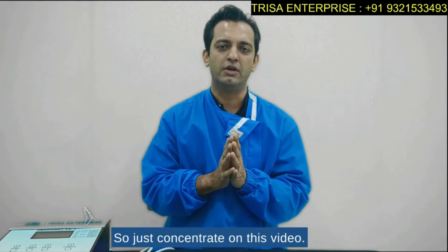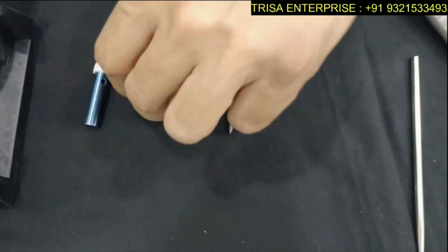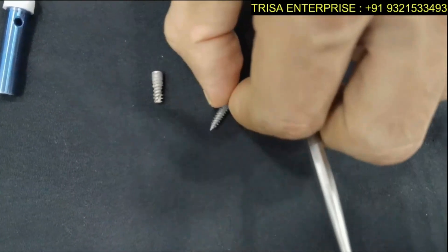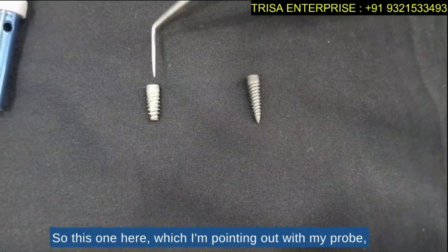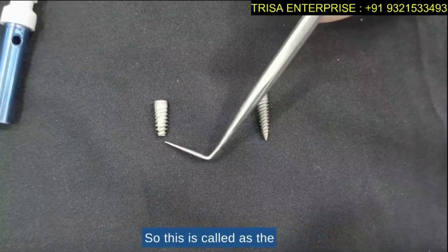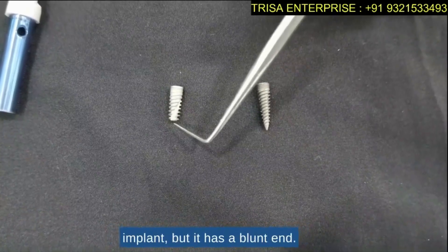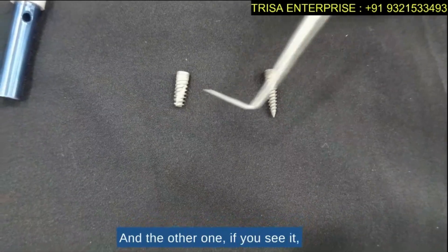First let me show you both implants. This is called the Dental Spiral Implant. As I'm pointing with my probe, you can see it has a blunt end — that is the DSI implant. It's a very aggressive implant but with a blunt end, so it is called the DSI implant.